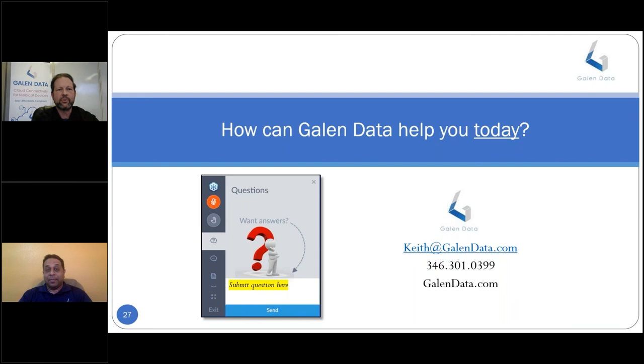Abbas, a question that came in during registration, which I think you covered during your presentation, but I want to add a little bit of flavor to it. Could you please touch base on cybersecurity-related aspects surrounding cloud-based connectivity? And you did. You spent a lot of time talking about that. But Abbas, would you agree that when we talk about cybersecurity, there are so many entry points, beginning with the device itself, the wearable, the implantable, through the web app or base station to the cloud connectivity? There are so many entry points for cybersecurity malfeasance that a cybersecurity strategy should be designed, or planned, with all those different entry points in mind.